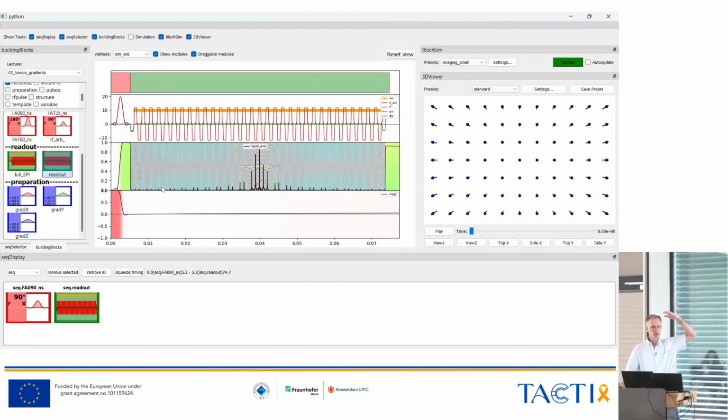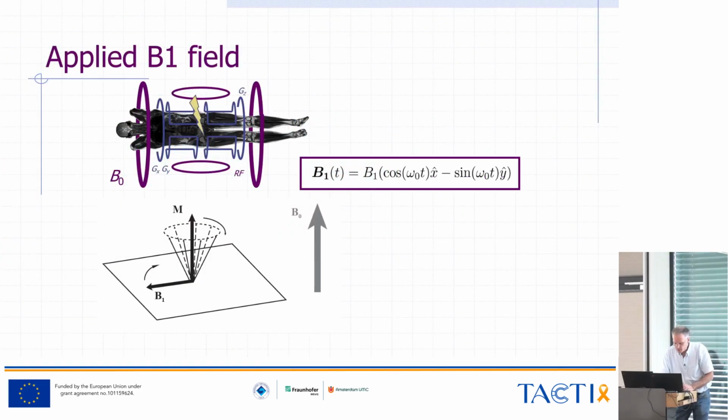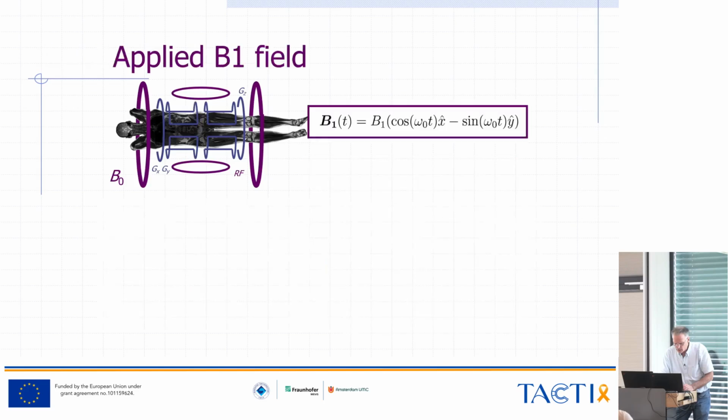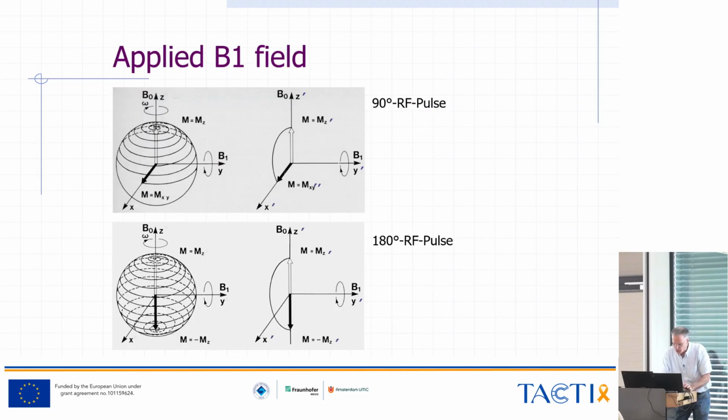If you remember how K-space looked like, I think I do have a slide here as well.